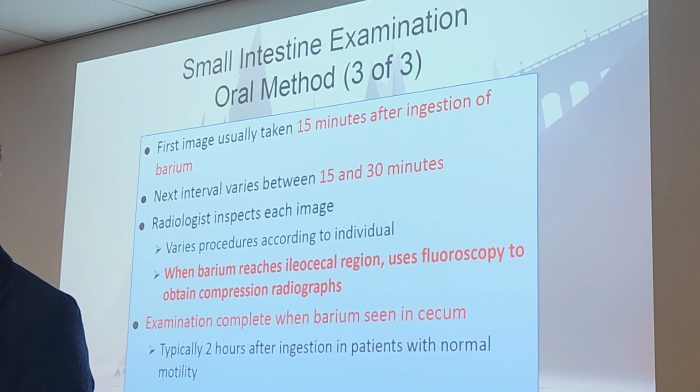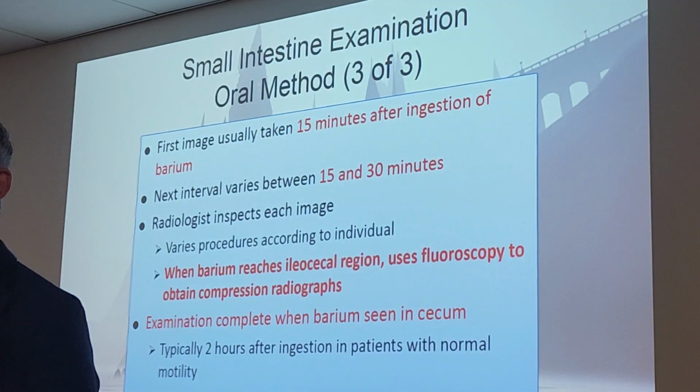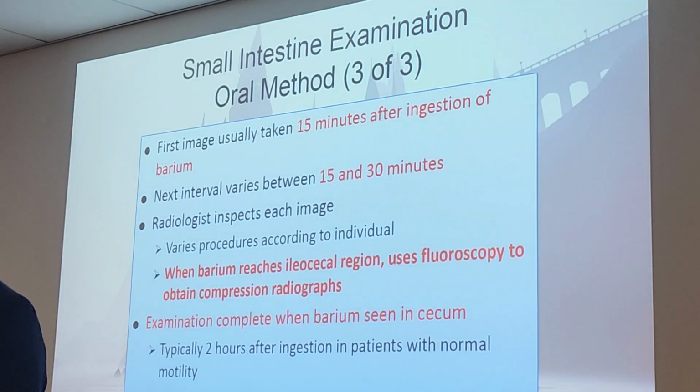The exam is complete once the barium enters the cecum. Big star on that too. Very important points. That's typically on average 2 hours after ingestion. It can be faster or slower depending on the patient, of course. 2 hours with normal motility, as they say.